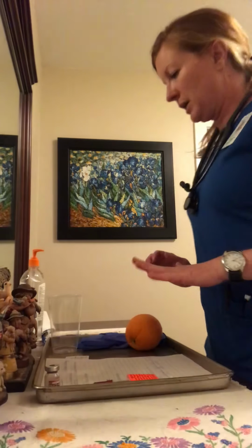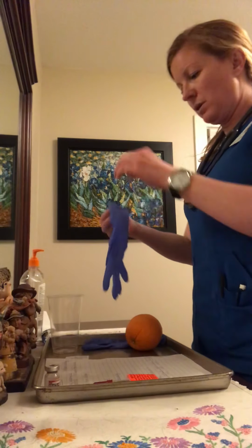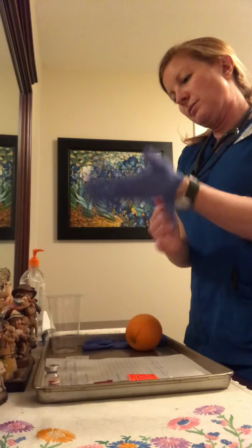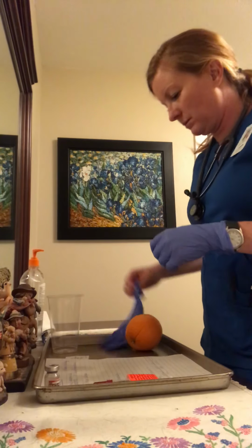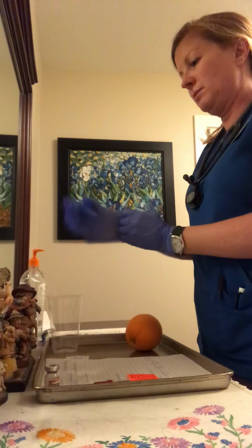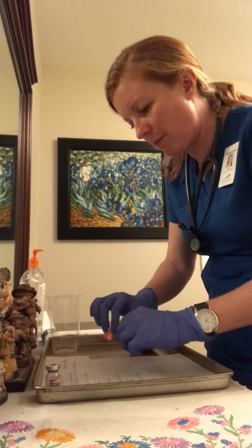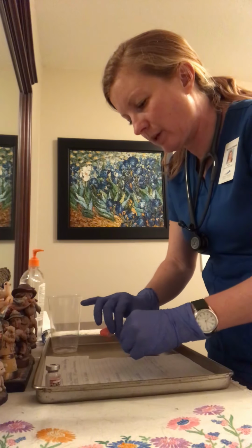Okay, so next we are going to get our gloves on. And I would loosen the cap on my syringe so it's ready to go.